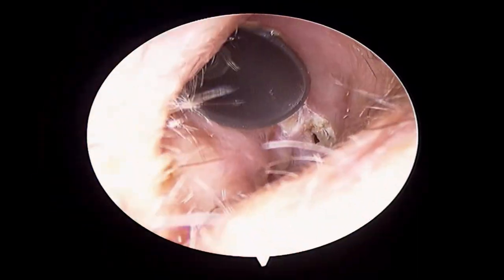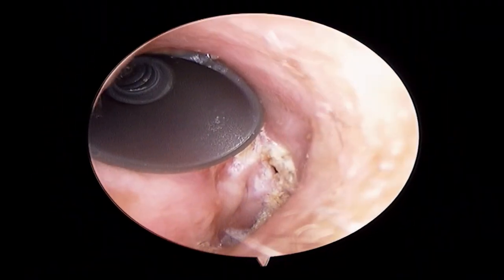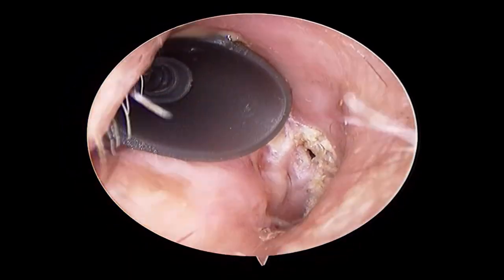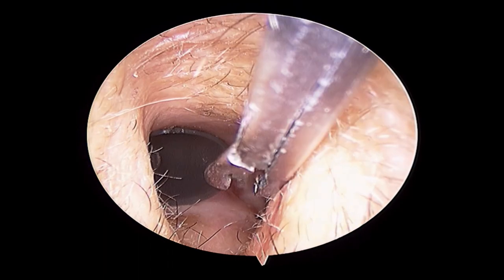Sometimes this is very difficult to remove, especially where the cavity is big and the opening is small. Any attempt by the patient himself may cause injury to the ear or eardrum, so you should not remove it yourself. Visit your ENT doctor.